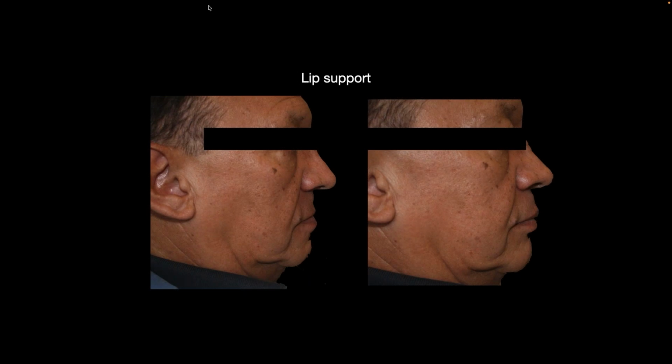The teeth also provide lip support, right? You have one of the pictures with the denture in and the other one with the denture out. And I certainly don't have to tell you which is which. You know, right?